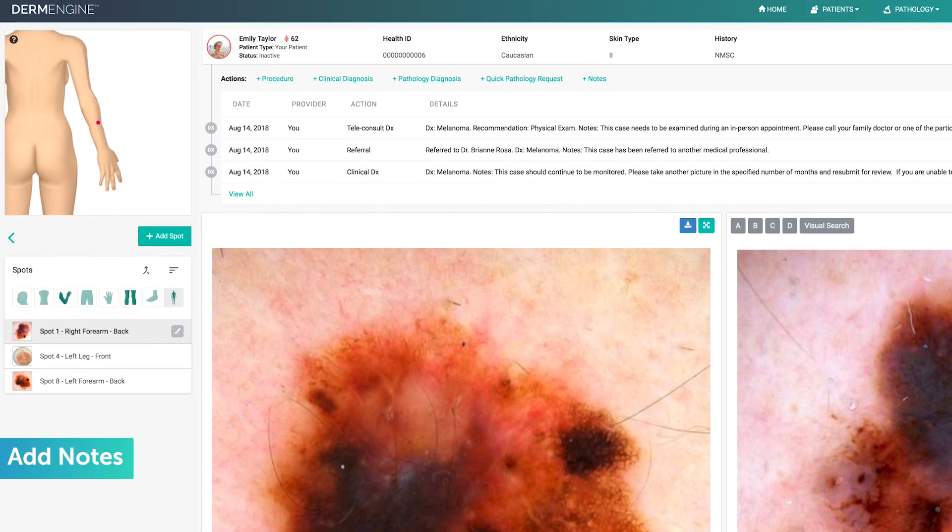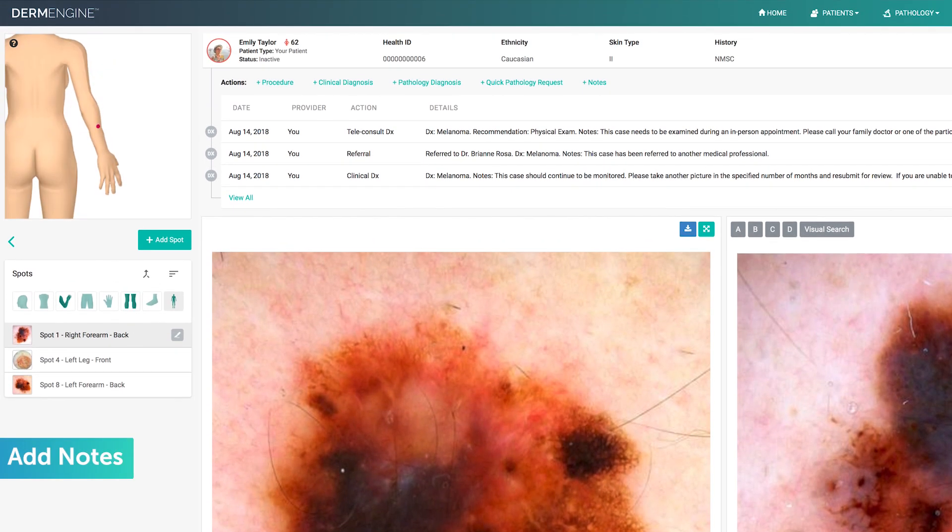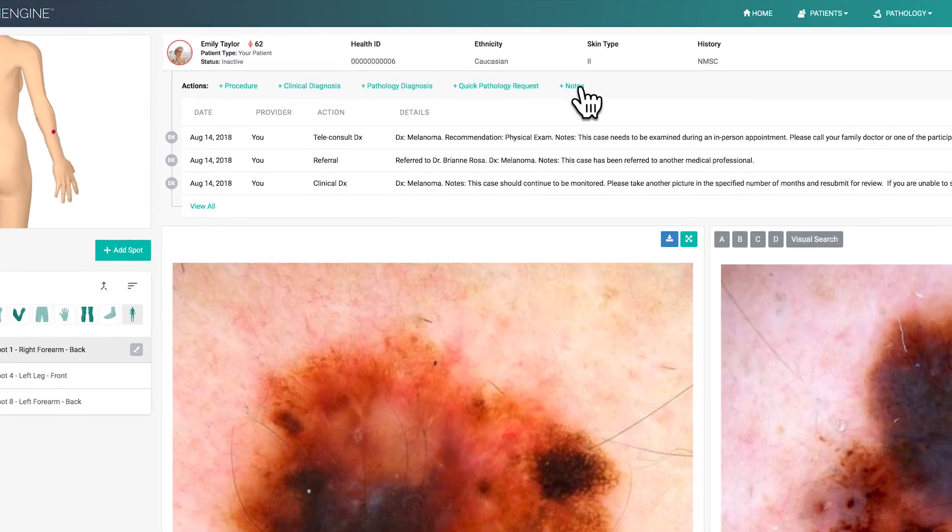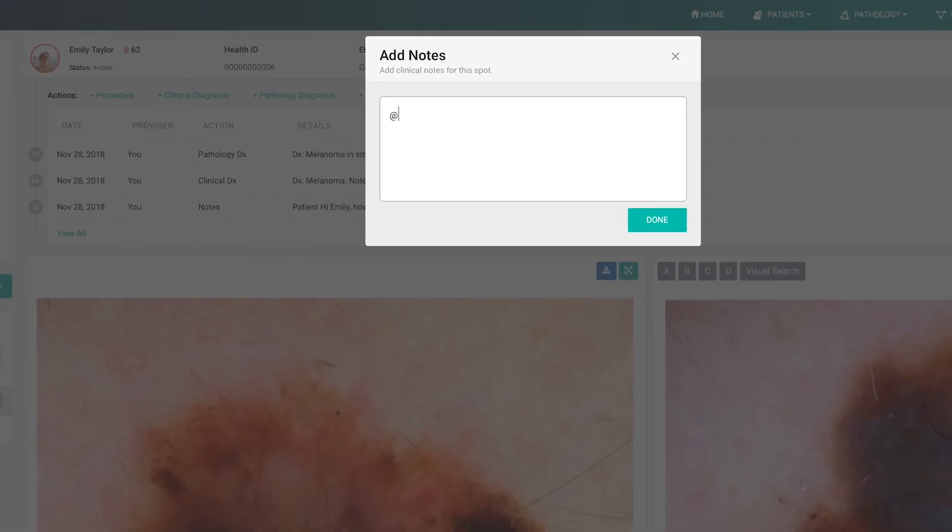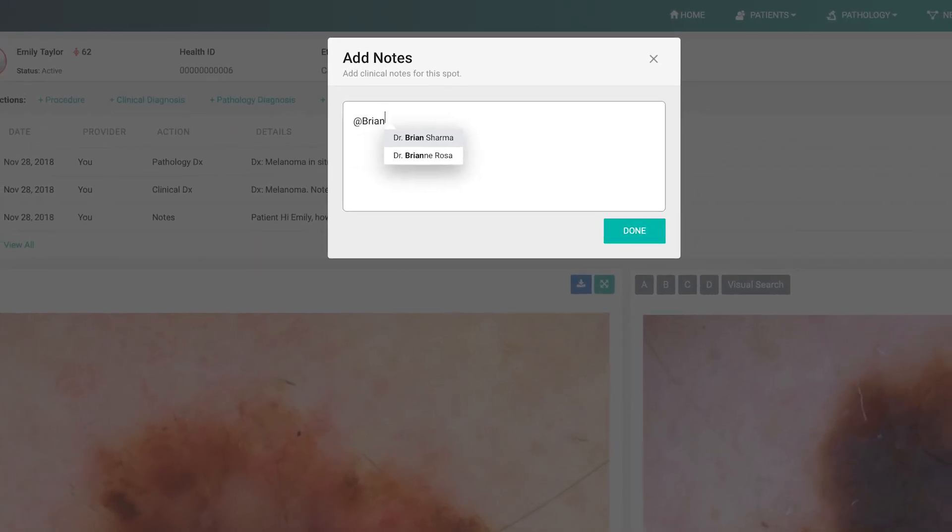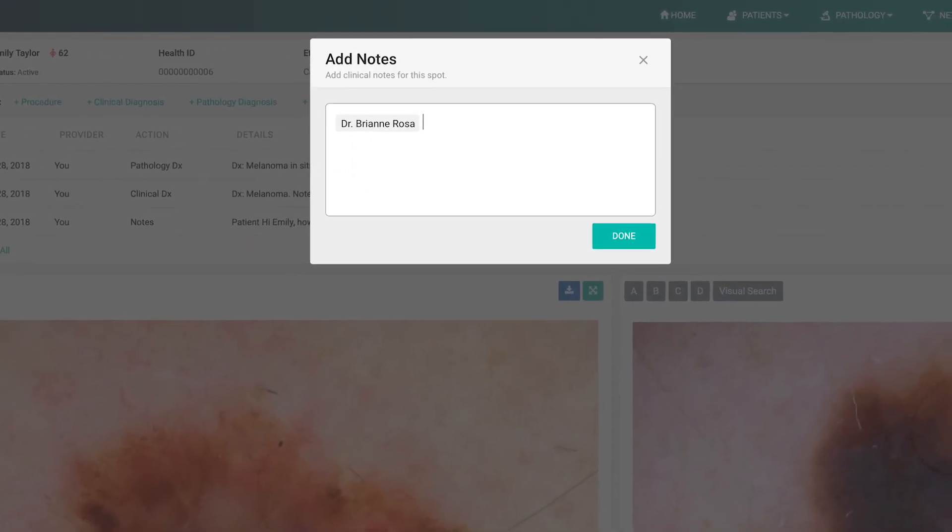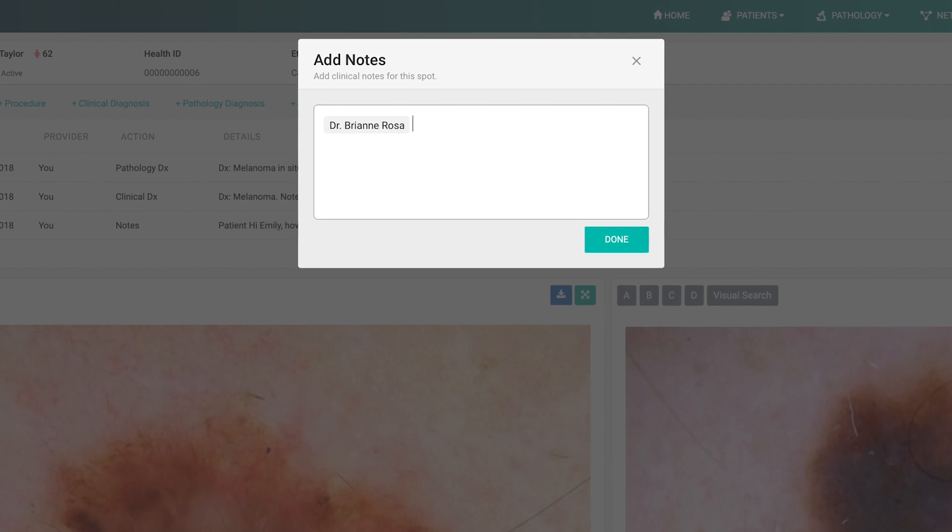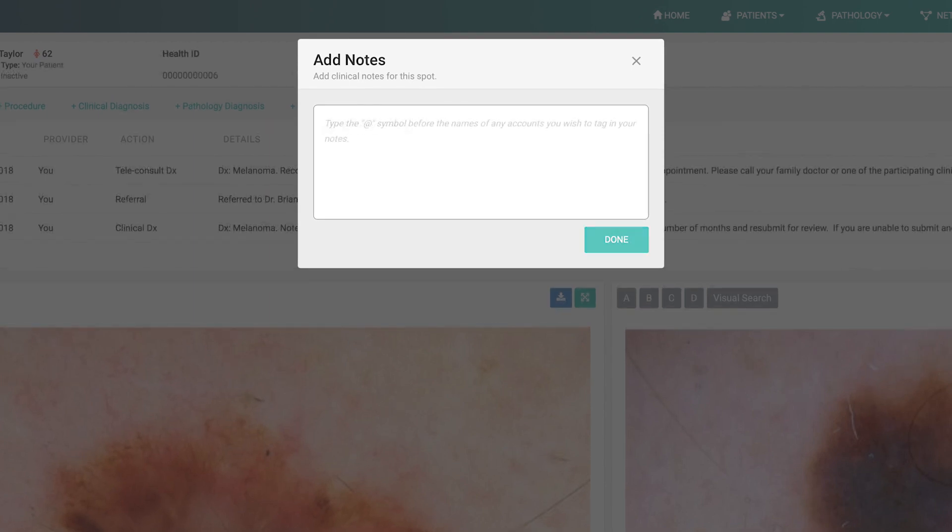Next up is the notes feature, which allows you to add notes to a spot. You can tag a colleague to view the case by typing the at symbol followed by their name. Also, you have the option of sharing your notes with your patients by typing at patient.